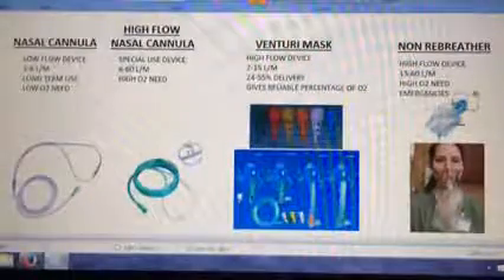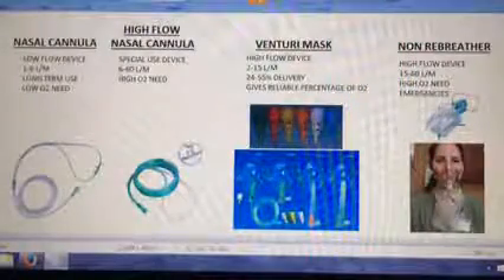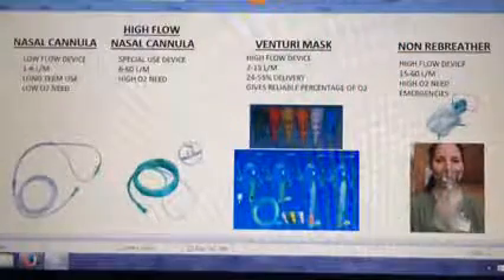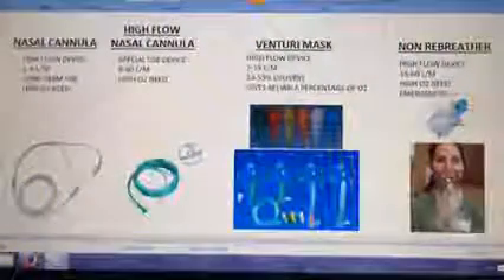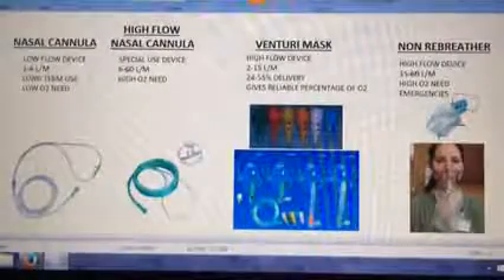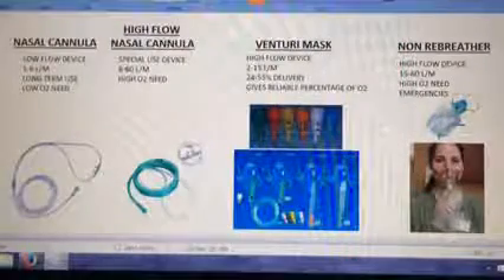I consider this device 100% oxygen. It has a reservoir bag to hold any excess oxygen for the patient to pull in when they breathe. There are two little one-way valves, one on each side. Take one off so the patient can still get regular air if it becomes disconnected. Some people take off both sides and call it a partial rebreather — I don't believe that's accurate. The only time I use this is if they have a high O2 need and I want to give them 100 percent.